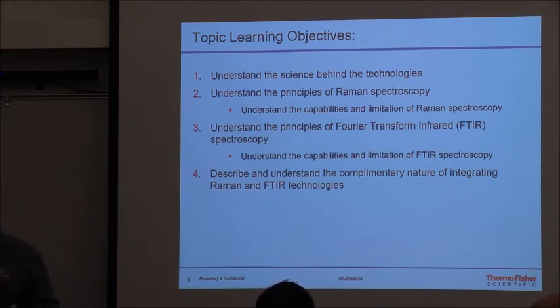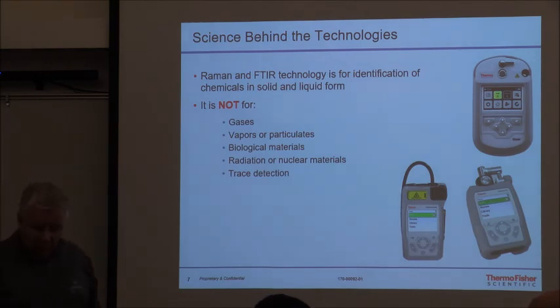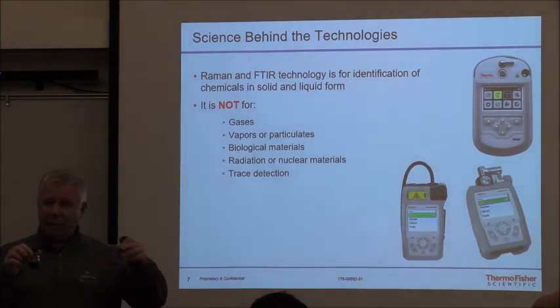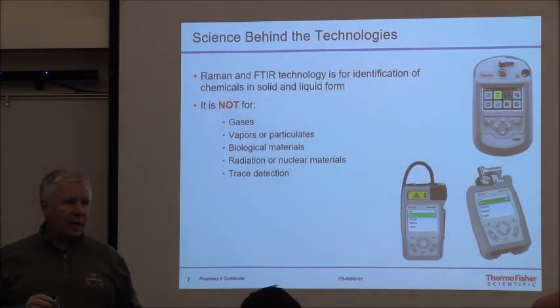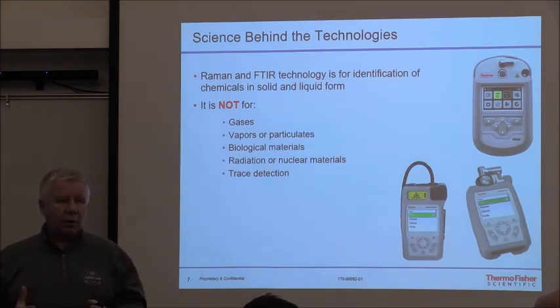They both work, they both do a tremendous job of what they're designed to do, but they each have a limitation, so we have to understand that limitation. They're not competing. So not designed for gases, vapors, not designed for biological and so forth. You notice here it says not designed for trace level detection. So if I took a product and put one little drop of it and I had like 0.5%, 0.1%, it's not going to find that trace level. It's designed as a chemical identification device, so it's finding materials inside, but it has to have enough product to see it. Okay? So typically I need 2, 3, 5% type of concentration.